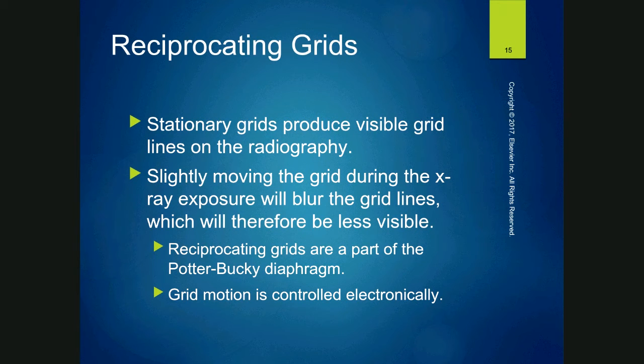Those of you who have been to Central Carolina Hospital, and you've heard that Wall Bucky, especially in room 2, the most commonly used room, it sounds like it's going to rattle the patient's teeth out because it's old. But that is the Bucky reciprocating during the exposure. So that's what you're hearing. Whenever you start to mash down your exposure button and you hear it, it's your grid actually shaking in front of your image receptor before you make the exposure.